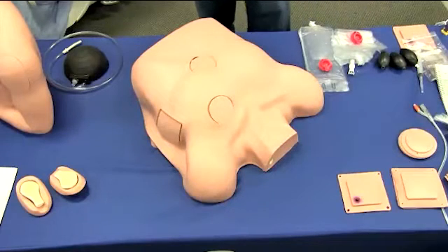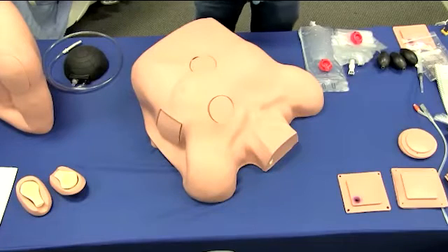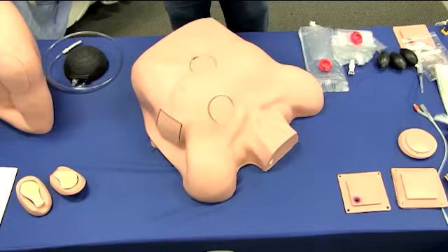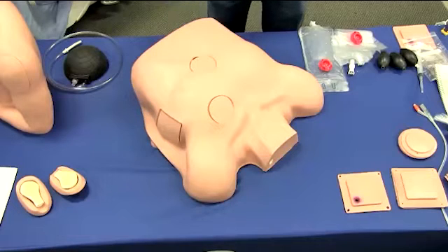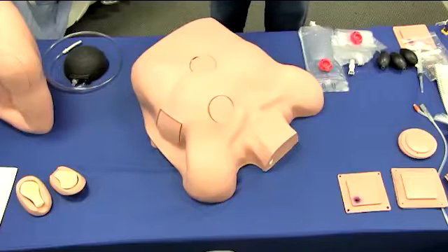Before proceeding, are there any questions at this time? Anna: I do not see any questions, but one thing to note is that the skin tone of this simulator is only offered in a light skin tone, as that question does come up from time to time regarding options. Thank you, Anna.